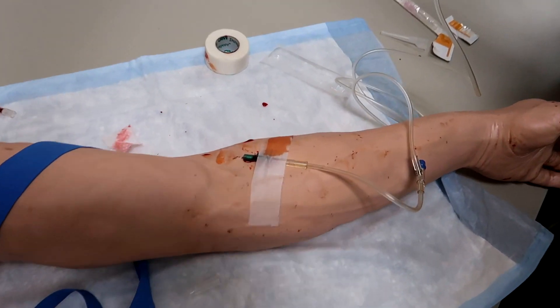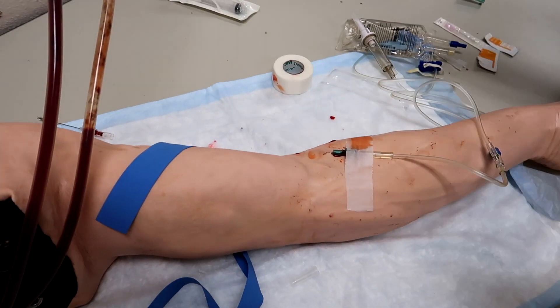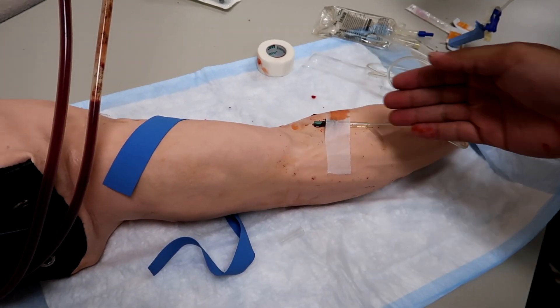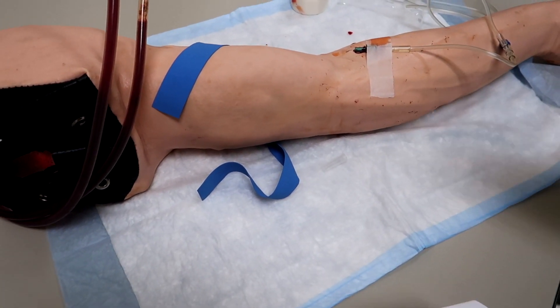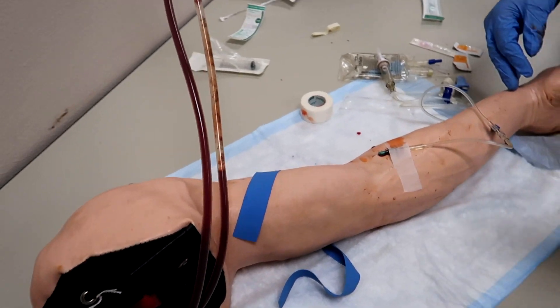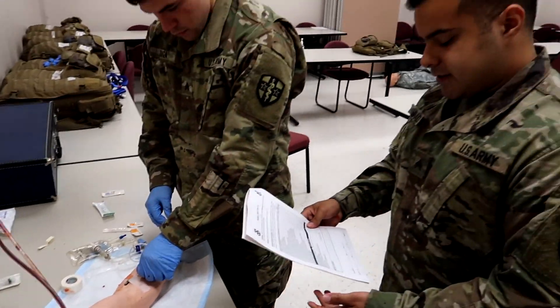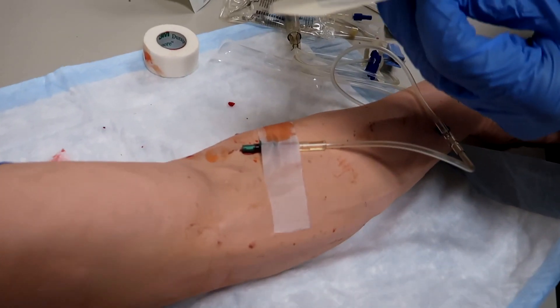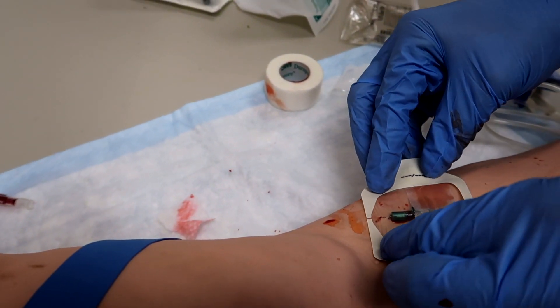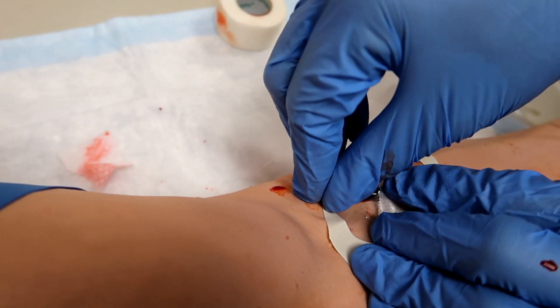He would cover with a transparent dressing and secure the IV tubing to the casualty. A good tip to check you're in there is to drop the bag lower than the arm — you'll see a return of blood going through the tubing and that means you're good. It's similar to a flush. Then raise the bag higher and fluids will continue to flow. Now he's placing the transparent dressing over the site, which prevents it from coming undone, getting loose, or dirty — it protects the overall site.